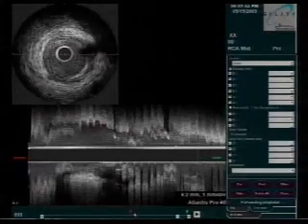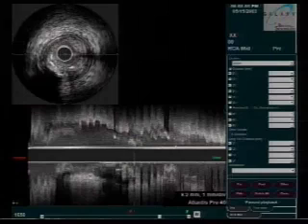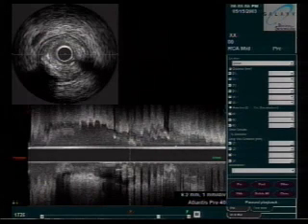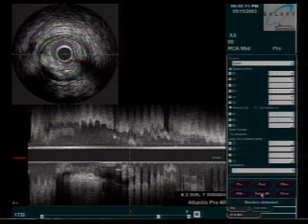Now, Mike, did you get a measurement for us to give us an estimate of how big this vessel is? Absolutely. First, I'm going to go to the area where we had the most severe stenosis. That's a good frame right there. It's about there. We're going to make some measurements here. The computer put down a first edition. I'm going to modify that a little bit. Actually, the artery wall on the outside. We'll try that one more time.